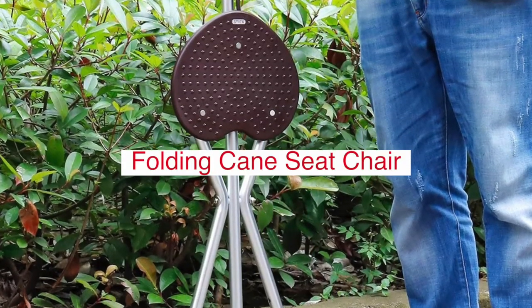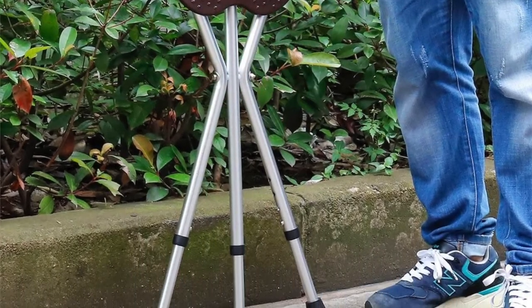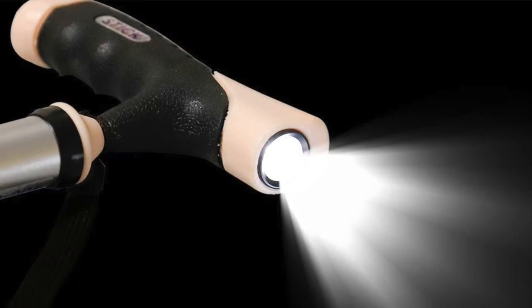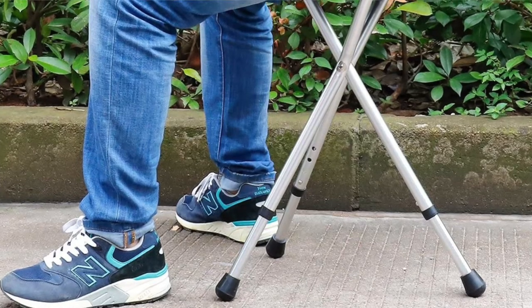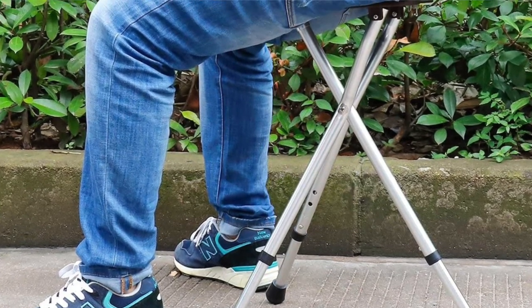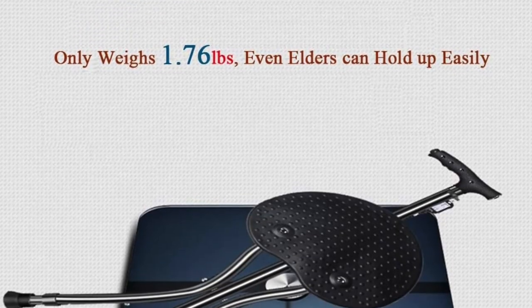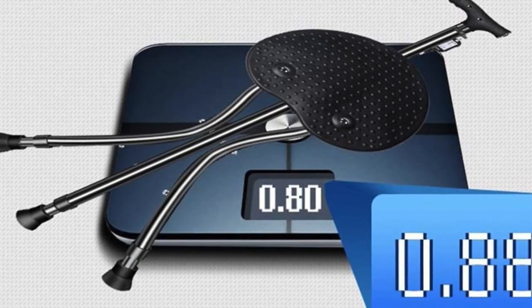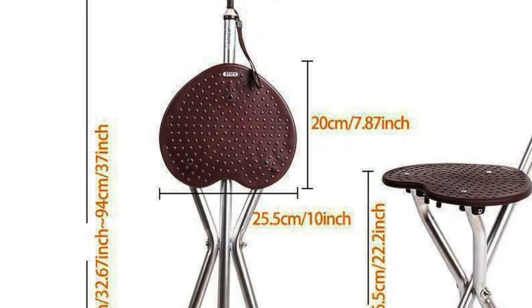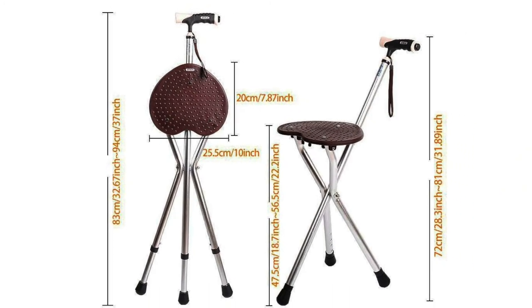The Folding Cane Seat Chair Adjustable Height Walking Stick with Seat Stool comes with a steady seat and a LED light. It is designed purely for convenience and can be used even at night. It comes in handy when stranded in an area without much light, as it can serve as both a walking stick and a flashlight, thanks to the two AA batteries included in the package. It has a solid aluminum frame and can carry up to 300 pounds of weight.